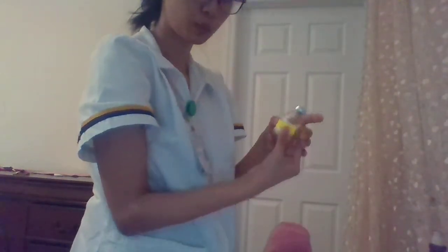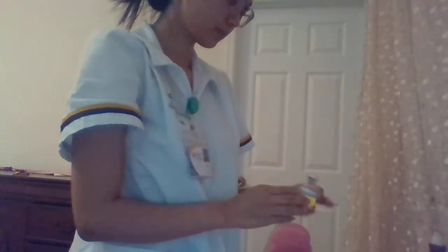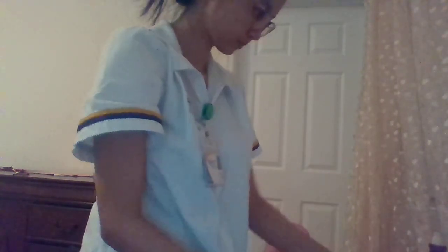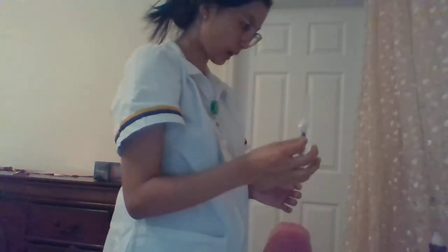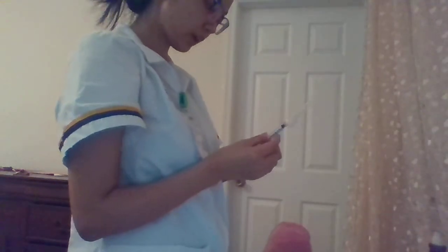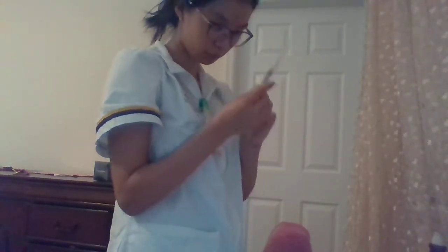And I put the label on my vial, not my syringe. After that, I'm going to draw back air equal to the ordered dose, which is 0.5 ml.